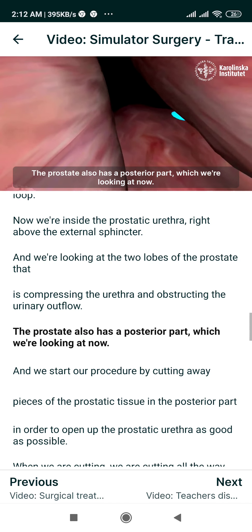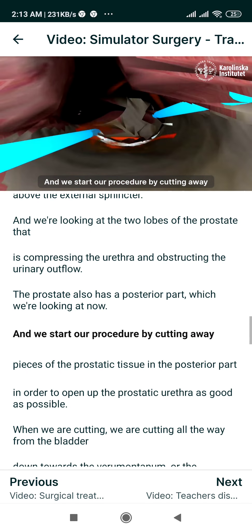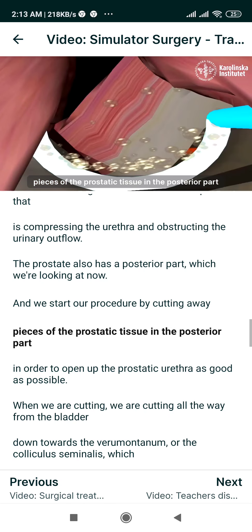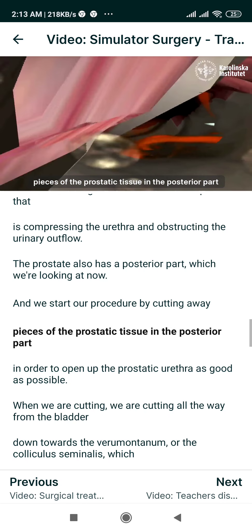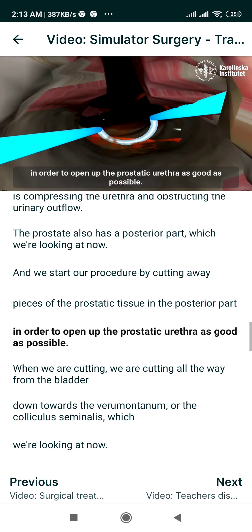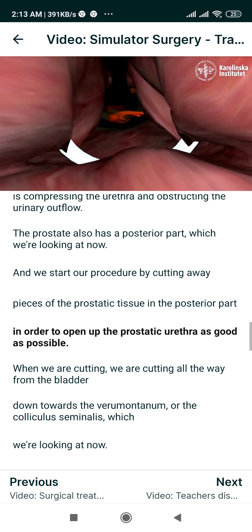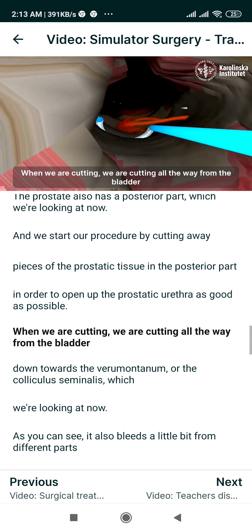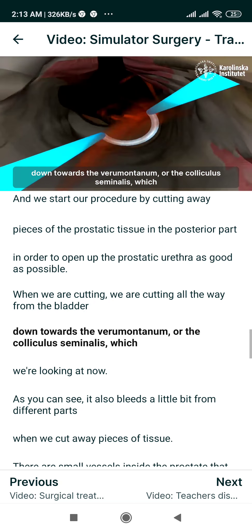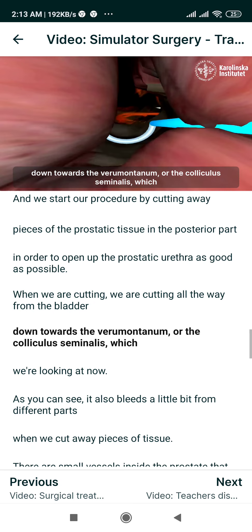The prostate also has a posterior part which we are looking at now, and we start our procedure by cutting away pieces of the prostatic tissue in the posterior part in order to open up the prostatic urethra as much as possible. When we are cutting, we cut all the way from the bladder down towards the verumontanum, or colliculus seminalis, which we are looking at now.